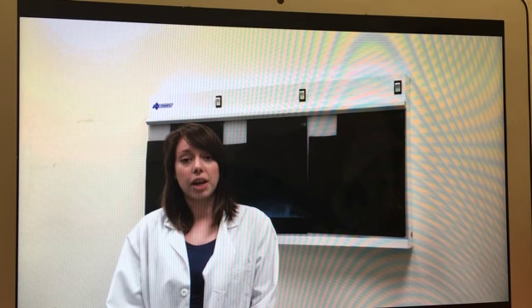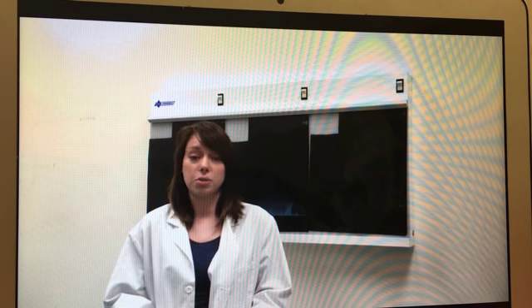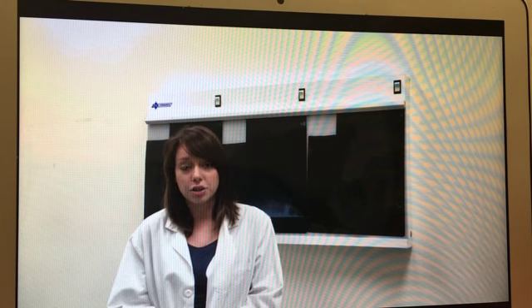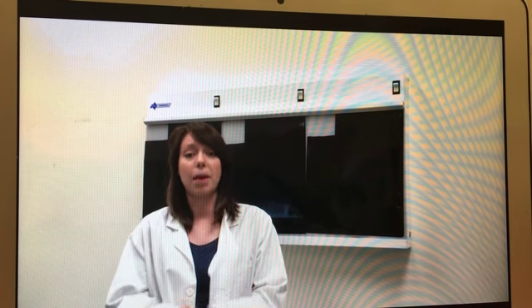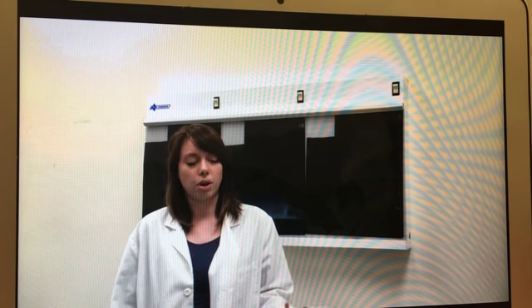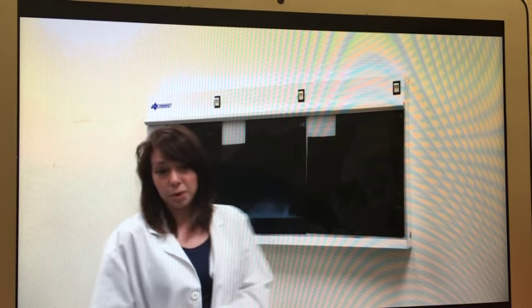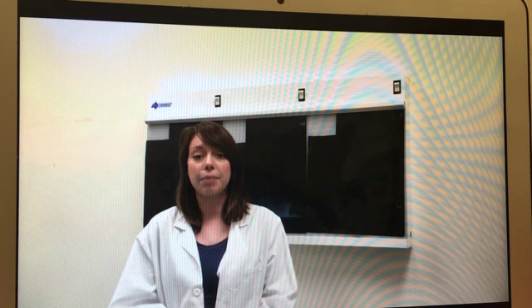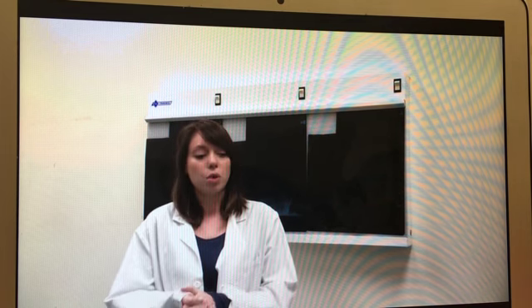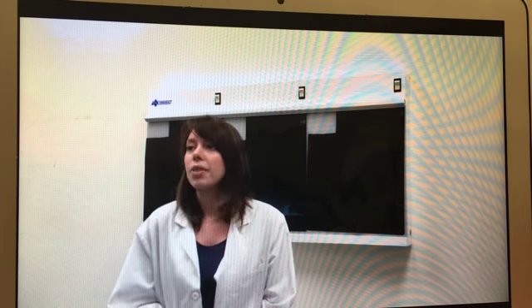She also experienced pain when going from a sitting to standing position, and she also experienced pain and discomfort when walking and weight bearing. For these reasons, I decided to do the exam on the table instead of weight bearing, because I felt that the lateral would be a little bit too difficult for her and too painful. So we did it on the table. We did the routine AP, sunrise, and lateral views of the knee. The AP was pretty standard. I used 60 kVp at 4.5 mAs.